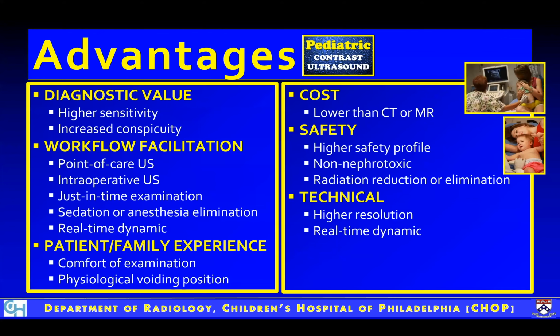Technically, you have a high resolution exam, which has been shown very beautifully, in addition to the real-time dynamic possibilities. And especially in low resource facilities or countries, that seems to be a good way to use for various indications compared to getting an MRI or CT.